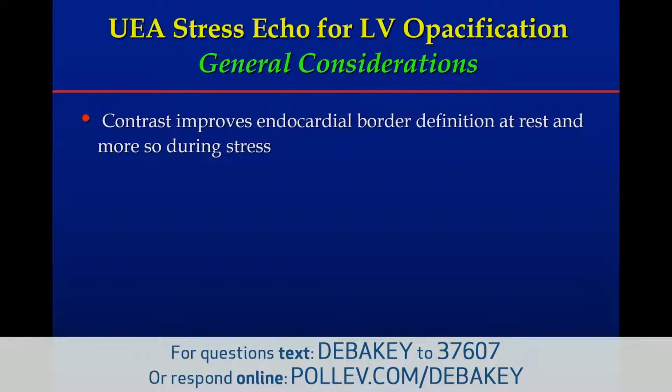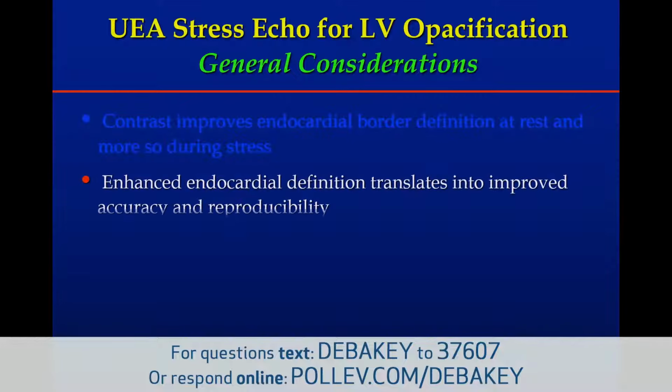So, ultrasound enhancing agents in stress. One, it improves endocardial border definition, no question about that.